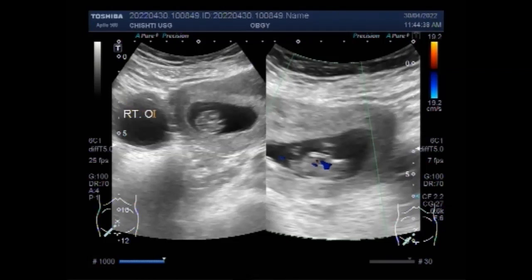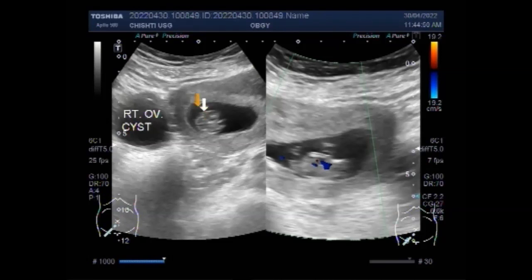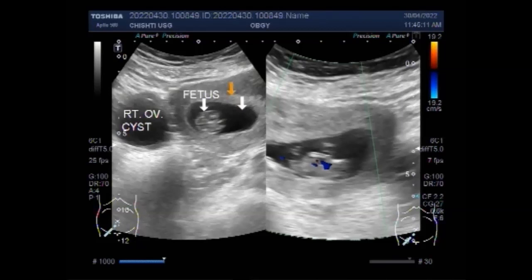If the cyst is over 5 cm in diameter, it may need to be surgically removed. This is a single, alive, active, and viable fetus of about 10.5 weeks with a right ovarian cyst in this case.